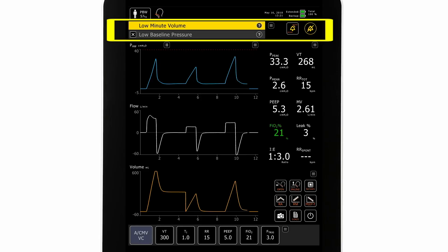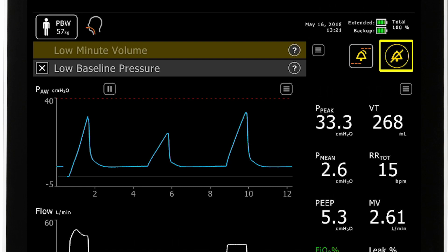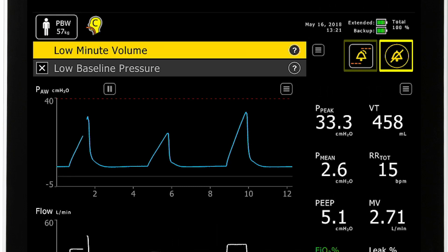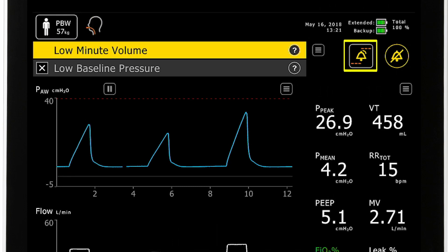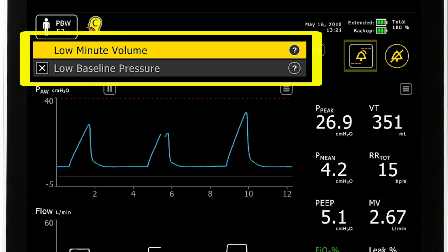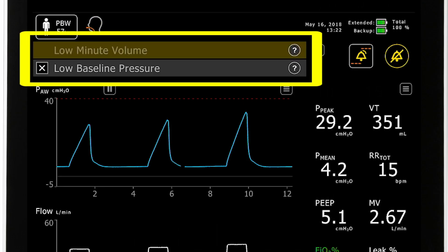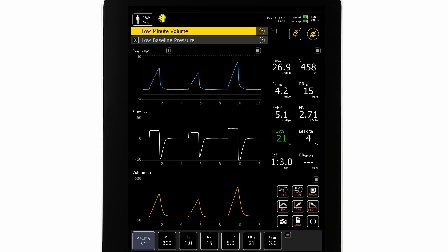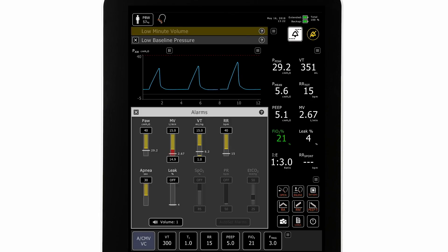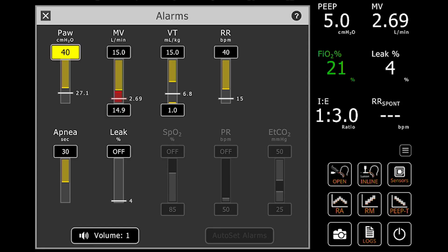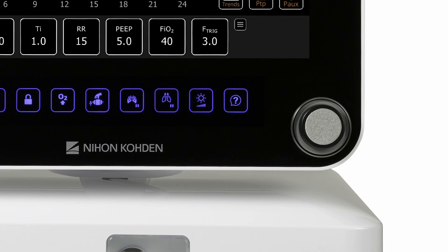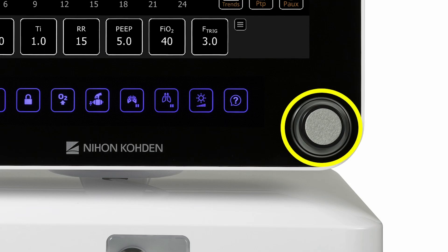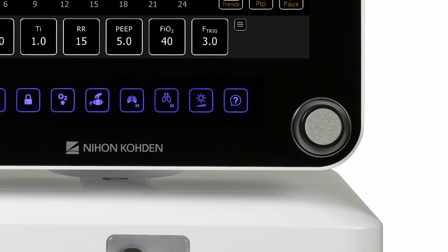The alarms area contains the audio pause button, the user-adjustable alarm settings button, and the alarm messages area. To set an alarm, the clinician selects the alarm settings button, selects the alarm they want to adjust, makes the adjustment with the encoder knob, then confirms the adjustment by pressing the encoder knob in.